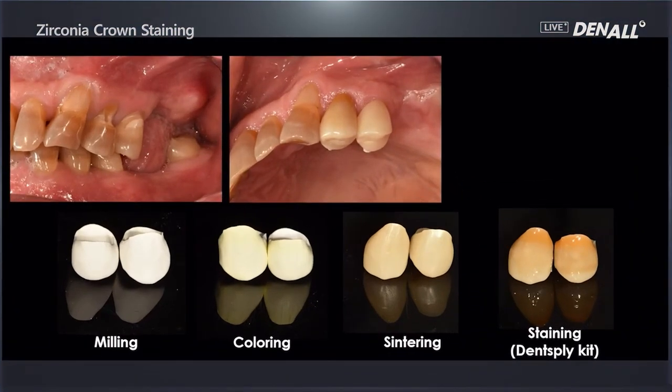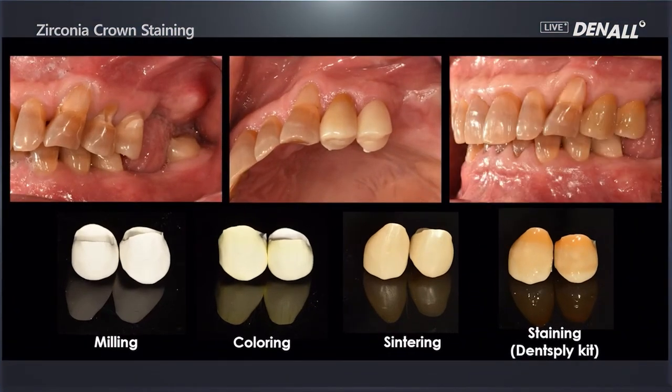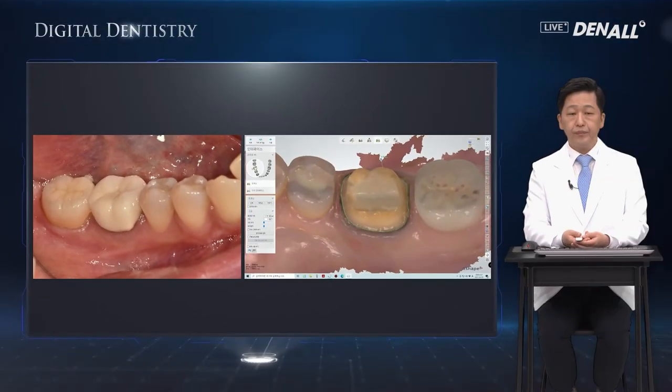This is before staining. This is the final staining result. The crowns are tried in and they look very similar to the color of the adjacent teeth. This is another case — in the lower jaw, the first molar on the right side, where the crown is to be remade.